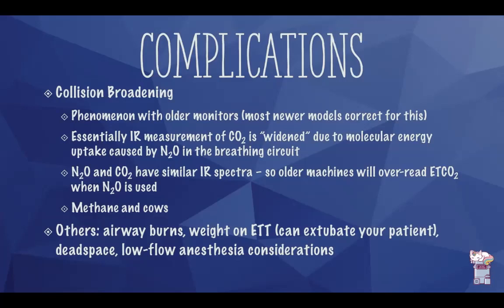Other complications that can occur when monitoring end-tidal CO2 include airway burns, the weight on the endotracheal tube, which can lead to accidental extubation of your patient, an increase in breathing circuit dead space, and considerations required for low flow anesthesia.